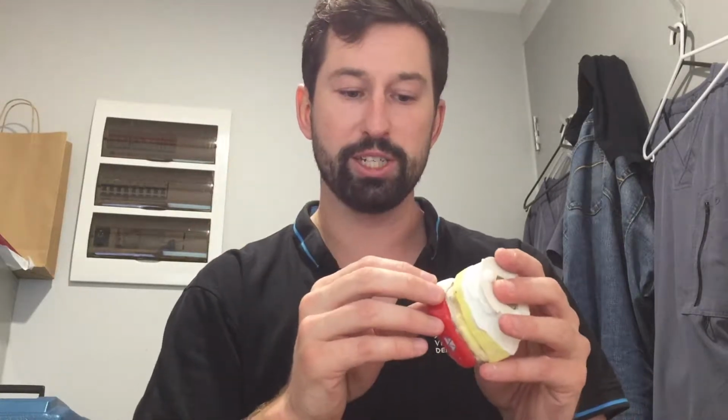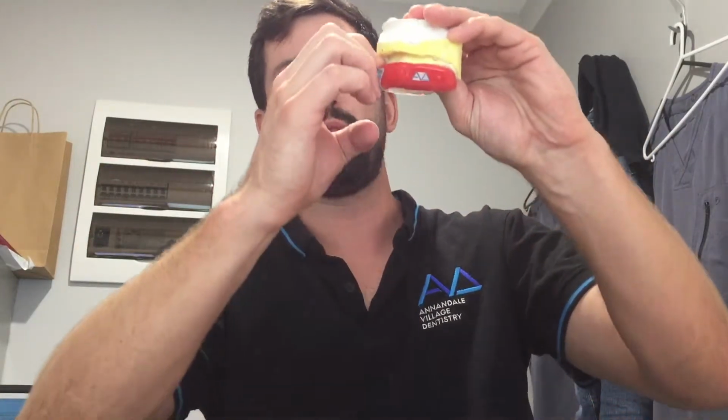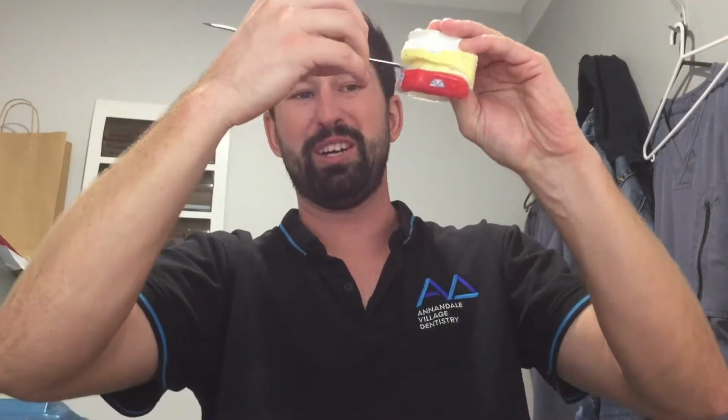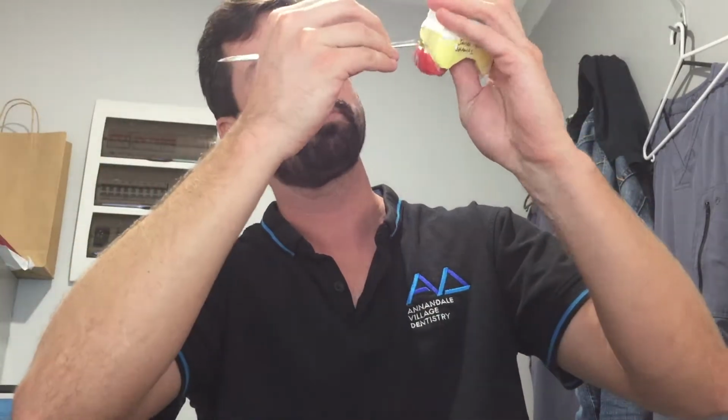This is my custom mouthguard here. If I click this into place and I do the same thing, it's not going anywhere. It's extremely retentive. If I push on anywhere, the only thing I'm doing is pushing it further onto the teeth, and it's not coming off. So the retention compared between the boil and bite and the custom mouthguard is not comparable at all. It's apples and oranges. If I really work to get this off, I'm really pushing on that, it's not coming anywhere. In fact, if I take a metal wax knife here, I really have to wedge it on all sides to get it off.